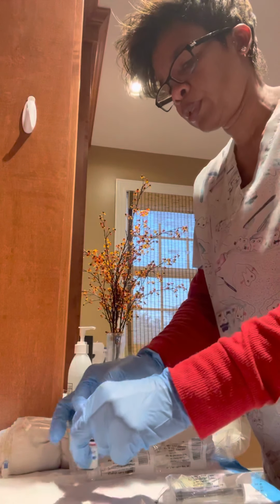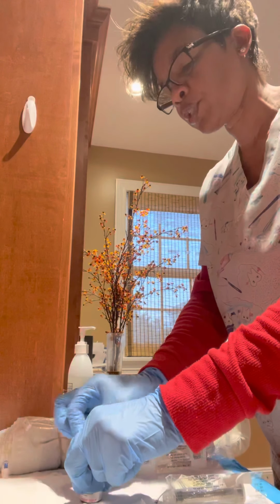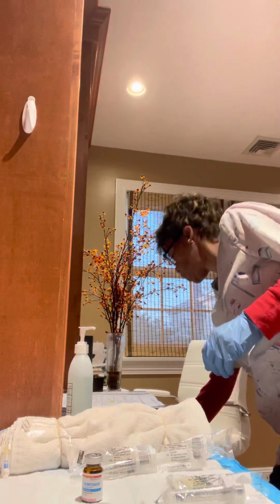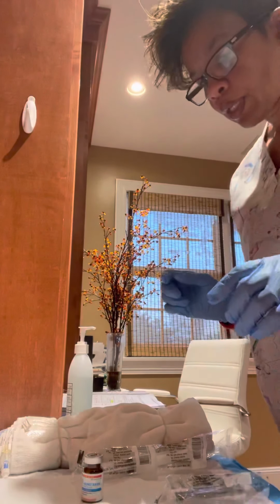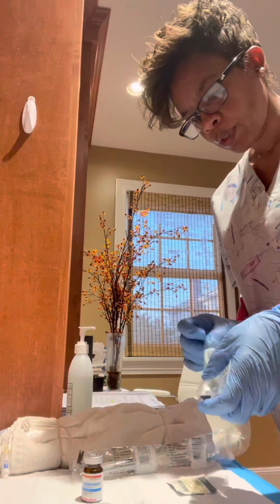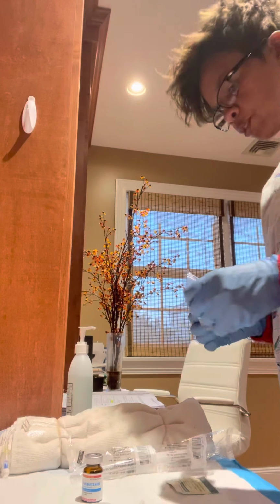Make sure. Okay, so I would clean it, circular motion, in and out. All right, so that's clean real well. And then I'm just going to get my 3 ml syringe.